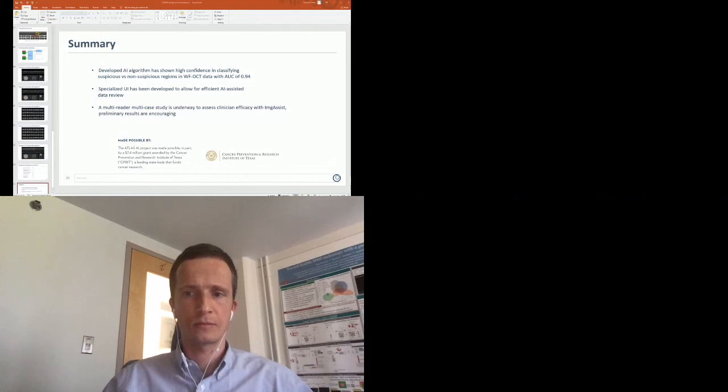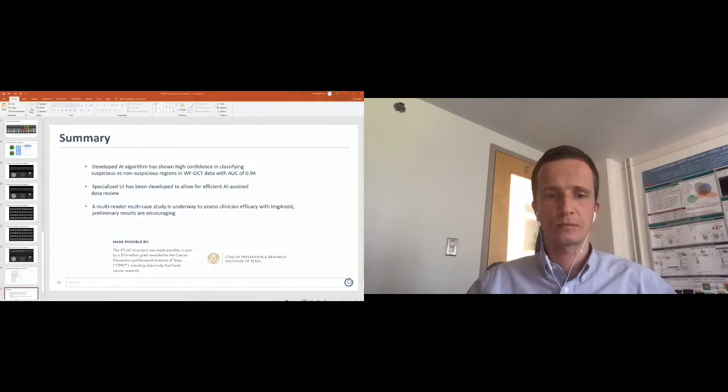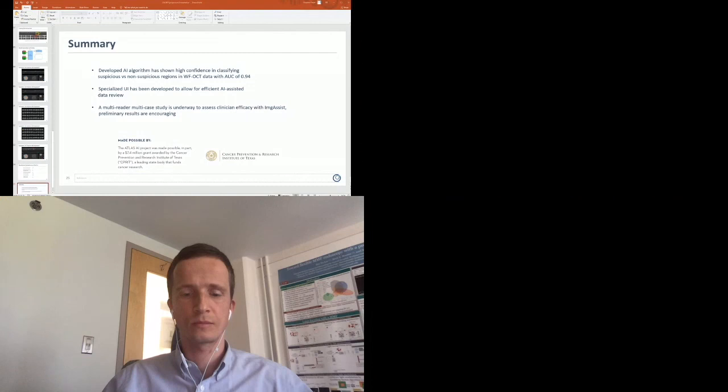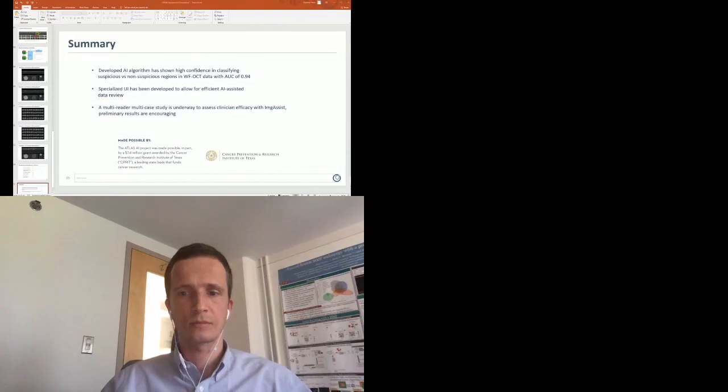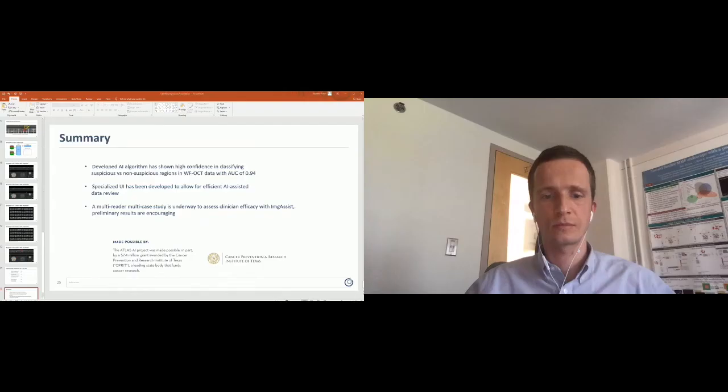So if your device is close enough to a predicate device, you can get this cleared. Otherwise, the approach would be to run a clinical trial and prove that you're delivering according to the expectations. I don't know if it answers the question, but it's a complex process. I believe the FDA has taken measures to speed up this process, but the time frame can still be quite substantial.